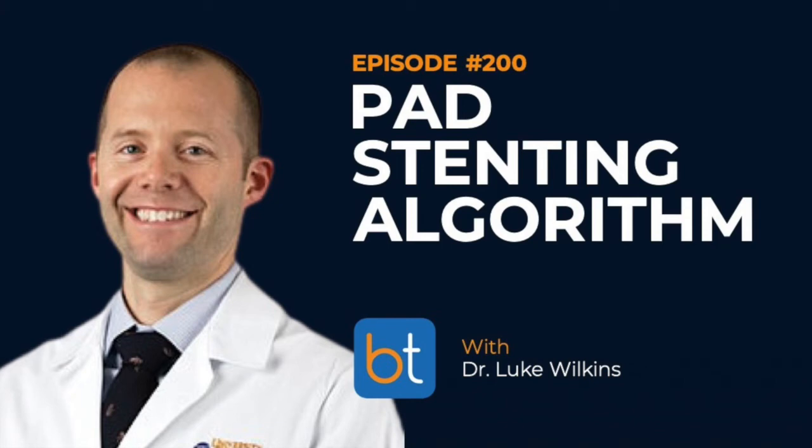I do try to get more aggressive with non-metal related techniques, such as more aggressive ballooning. And I don't mean higher inflation pressures. I just mean longer balloon inflation times. I try to get more aggressive with excisional plaque removal with directional atherectomy. And you could also consider tacks, which, if you're not familiar with them, are very, very short stents, basically one strut length, just used to tack up small areas of dissection flaps. Yeah, I haven't had a chance to use those yet.